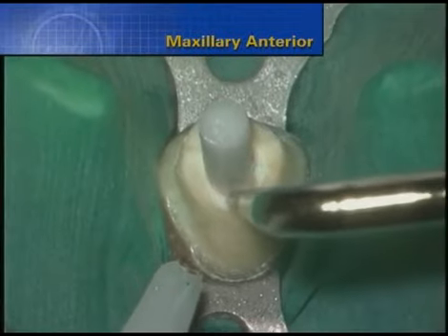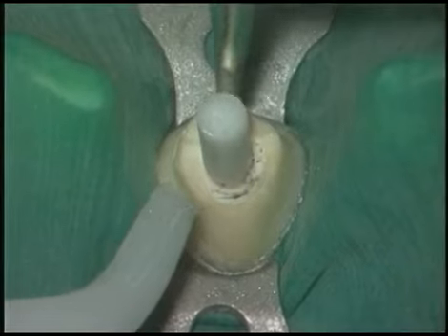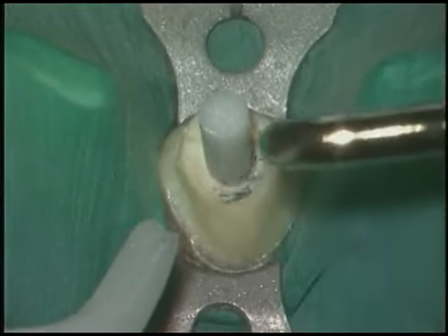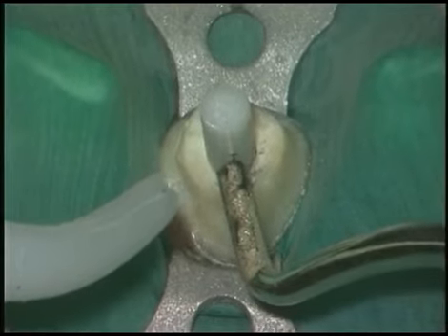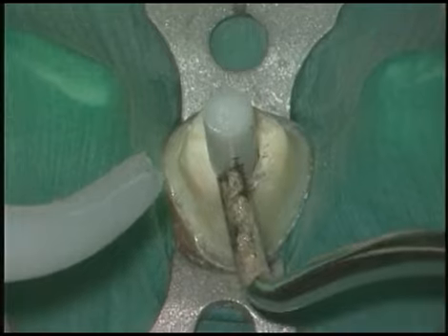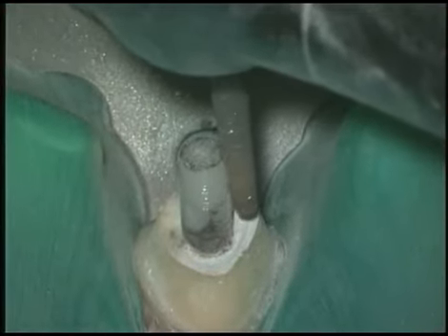Here is a maxillary central incisor with a large fiber post. Specifically, this is a Serra post distributed by Brasler. Ultrasonics is not that successful typically to remove these posts because in the advent of aesthetic dentistry and adhesion dentistry, these posts are substantially more secure in the roots than their metal post counterparts.